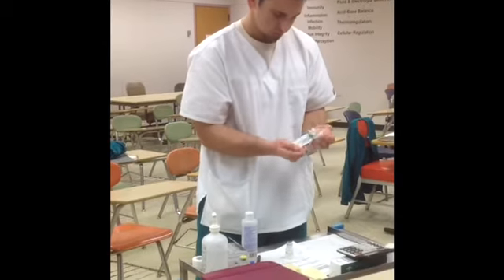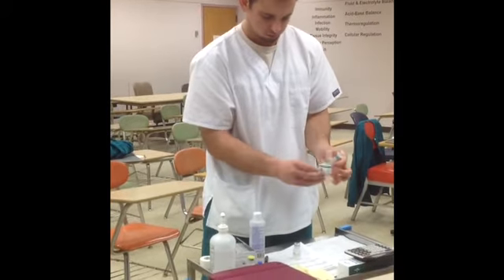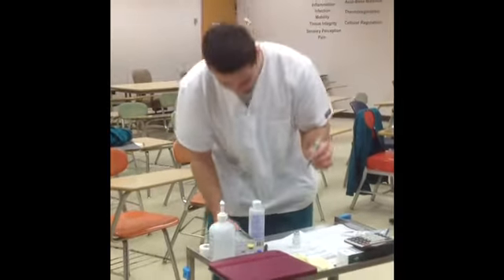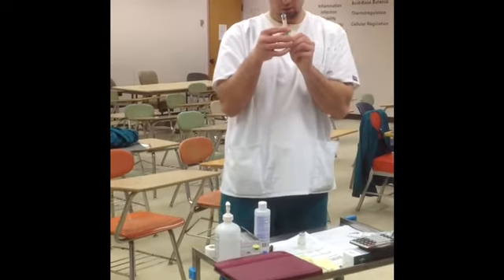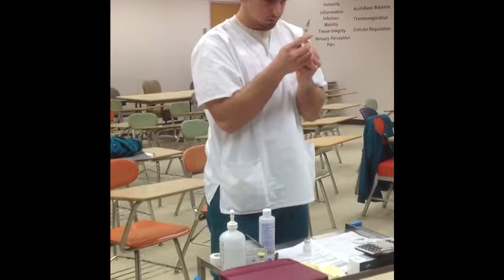Open this up. Careful not to touch the insides. Alrighty. I already cleaned it off. So actually, first I want to aspirate some air. So it's going to be 1.2 mLs.